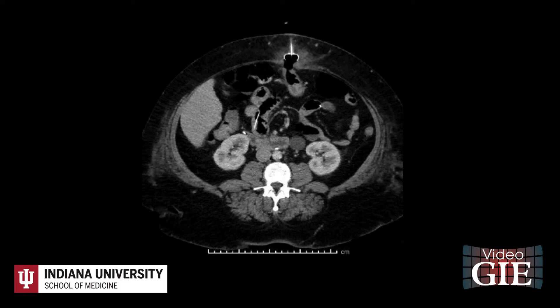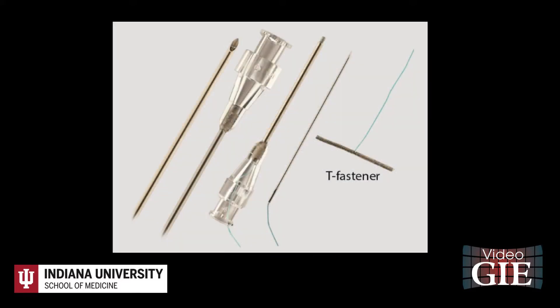Treatment options and risks were discussed with the patient, including surgery or endoscopy. The patient opted for endoscopy. A gastropexy was performed under endoscopy and fluoroscopy guidance using a COPE gastrointestinal suture anchor set. This included two spring coil suture anchors, or T-fasteners, an introducer, and a loader.